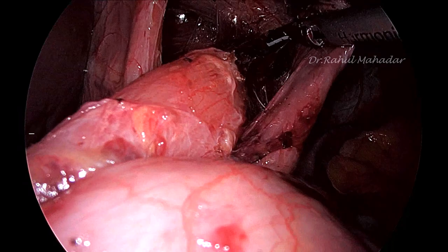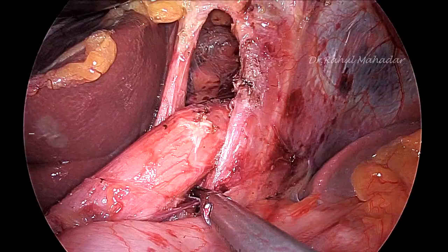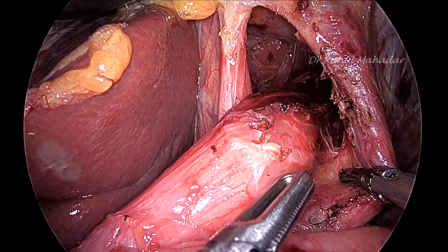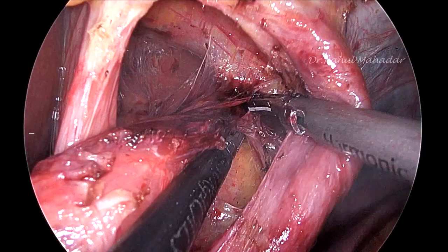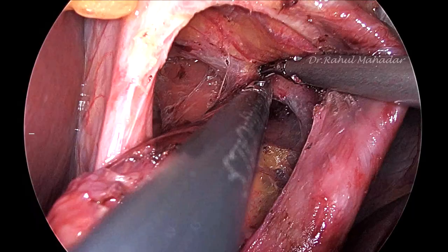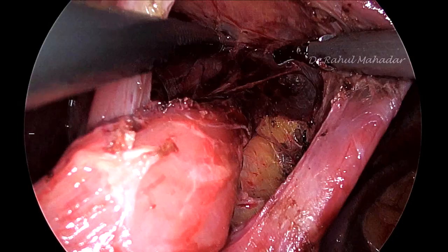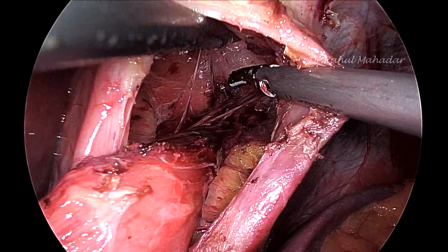So you can do the lateral dissection. Here also there are chances that you can injure the pleura on the left side. So try to avoid that. And all the attachments of the lower esophagus with the crura are taken care of with a harmonic scalpel, and you can very well see now the aorta down. So slowly you can dissect all the structures. There is a pericardium above, so you have to just dissect in between that. All small fibers are taken care of with the help of a harmonic scalpel.